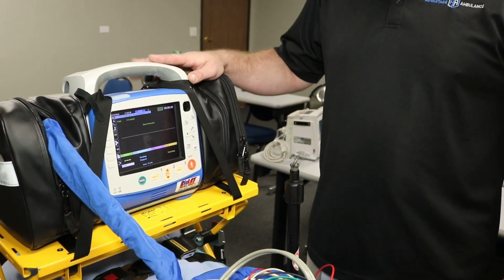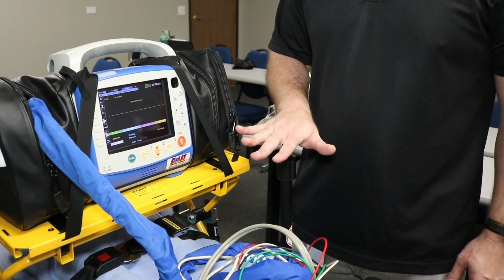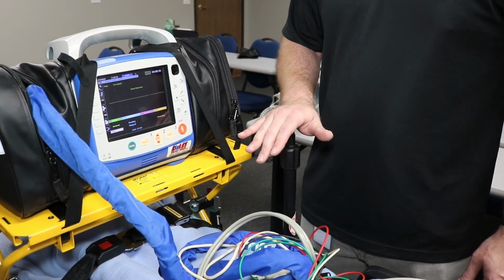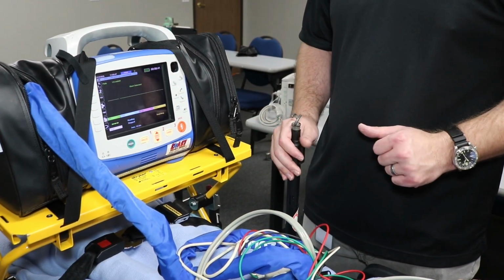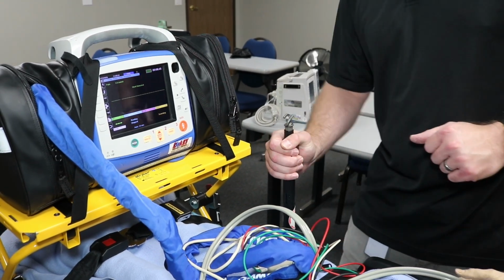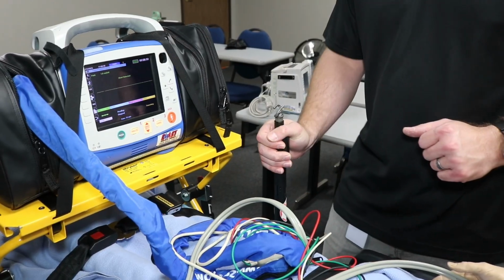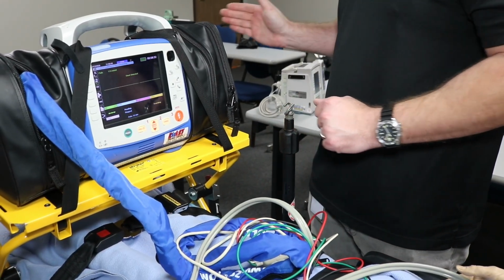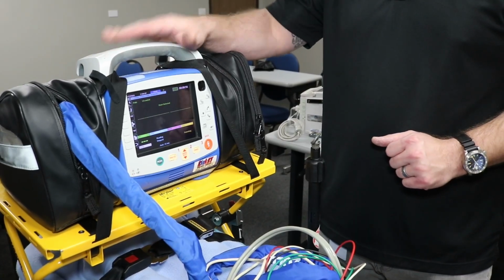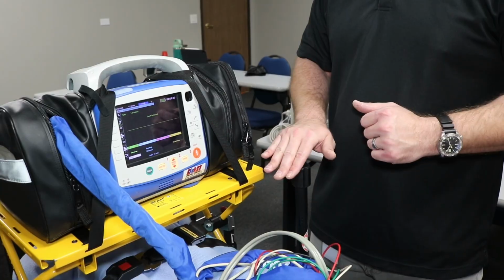If the patient is on any drips or any fluid where we might have to utilize our pump, let's go over how to secure our pump to our IV pole. The pump is fairly large, can be a little heavy, so we want to make sure that we have this securely fashioned and tightened down really good so that it does not fall on the patient. The pump can also be mounted to the tray if we need to, and we're utilizing multiple channels and it's a little too heavy for the IV pole.